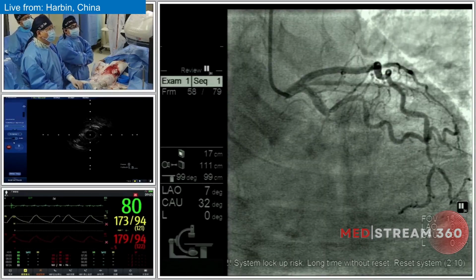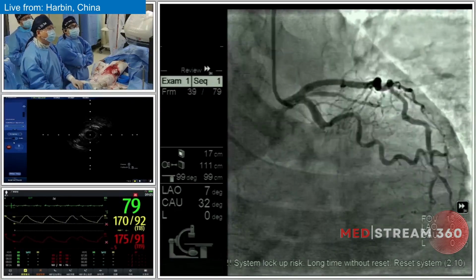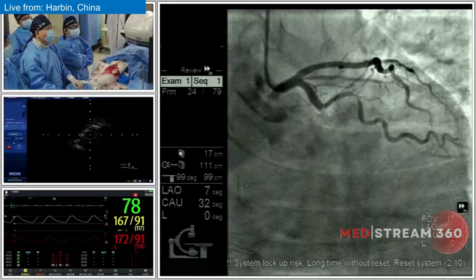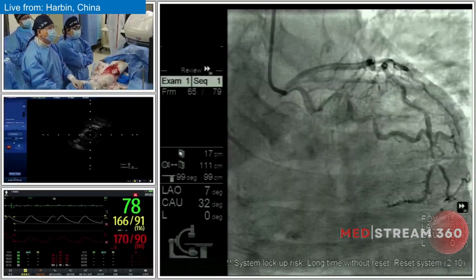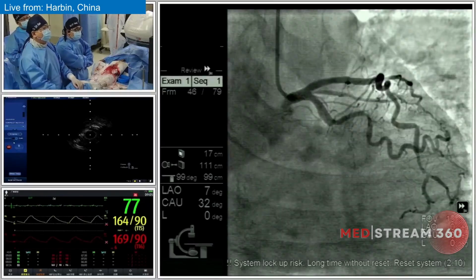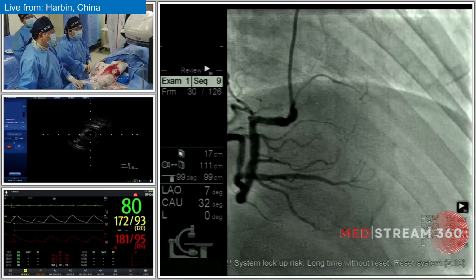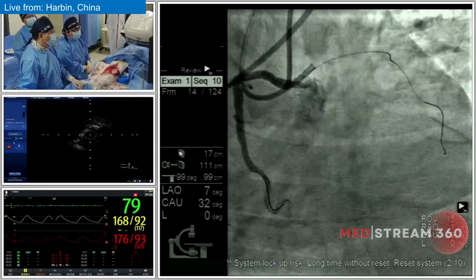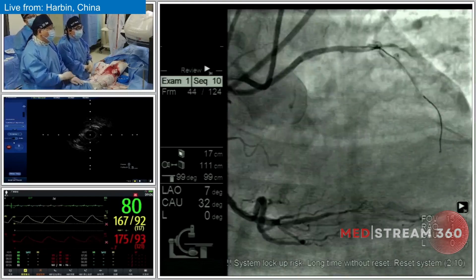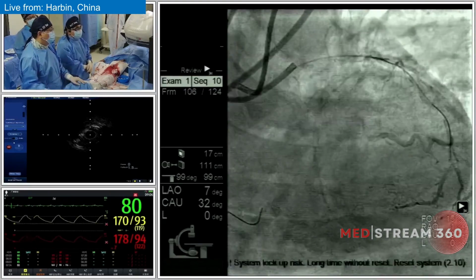Firstly, from the CTA result, we can find the proximal cap is located just at the bifurcation from angiography. Carefully, we can see the tapered cap. Next, from the dual injection, we can see several epicardial collaterals from the RCA, but they are very small.